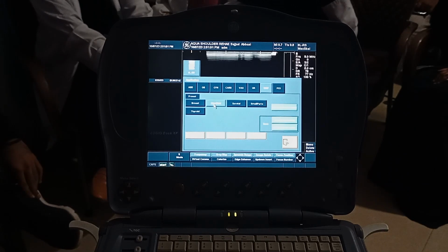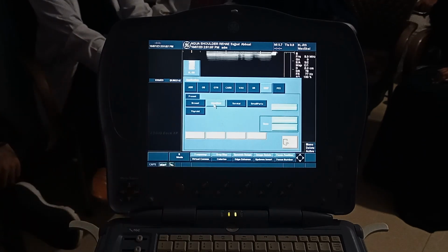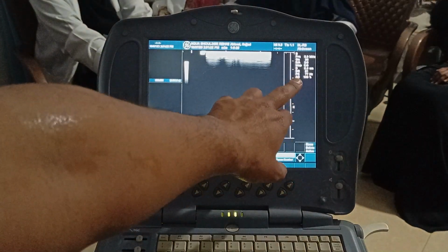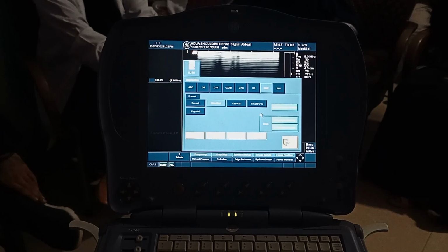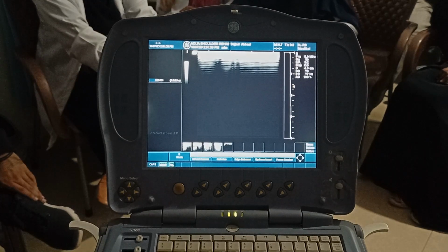This is sort of a setting in the camera. For example, auto, fast, moving, sports, whatsoever, there are a lot of features. So that's how you can select. For example, if I want to select the abdominal, it will load the abdominal features, and now everything on the screen has changed. You can see the frame rate has changed and everything is changed. And now if I go to small parts, and I can select the musculoskeletal again, and then you can scan the musculoskeletal system.